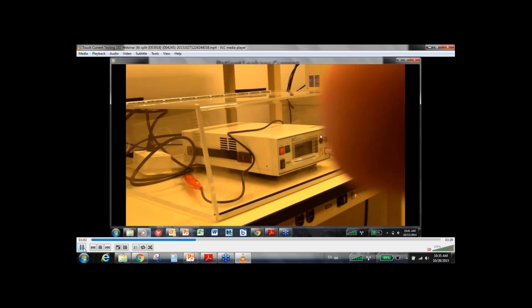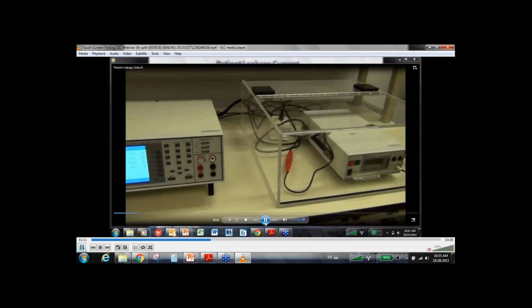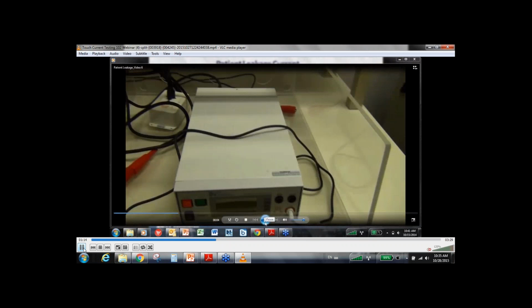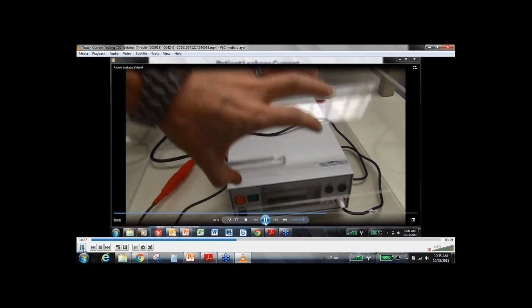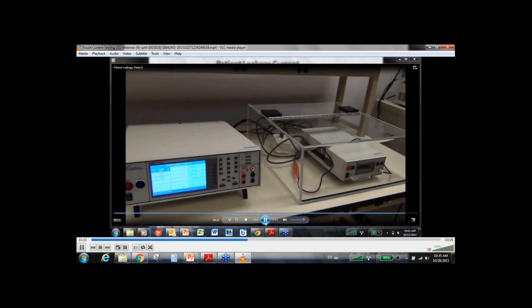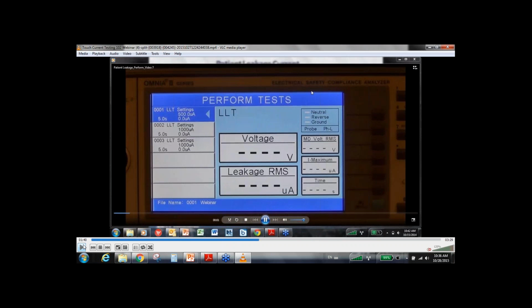We're going to be using one of our HiPot testers as a medical device to perform the patient leakage test. What we're doing here is we have our tester that has one connection point, acting as a patient lead, and we're connecting that point to our probe high connection, and this will put the measuring device between this point and the line, or the reference back to the lower end of the transformer. Again, this connection is for patient leakage, so we're actually testing the lead that's coming out of our tester back to the system reference and putting the MD between those points.